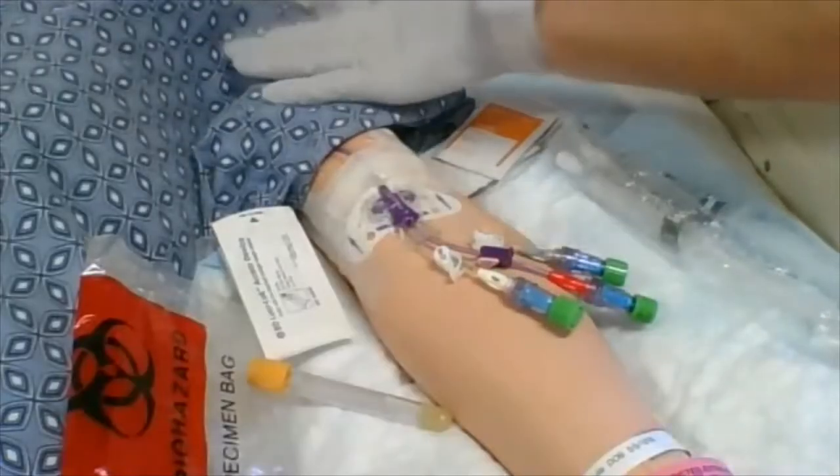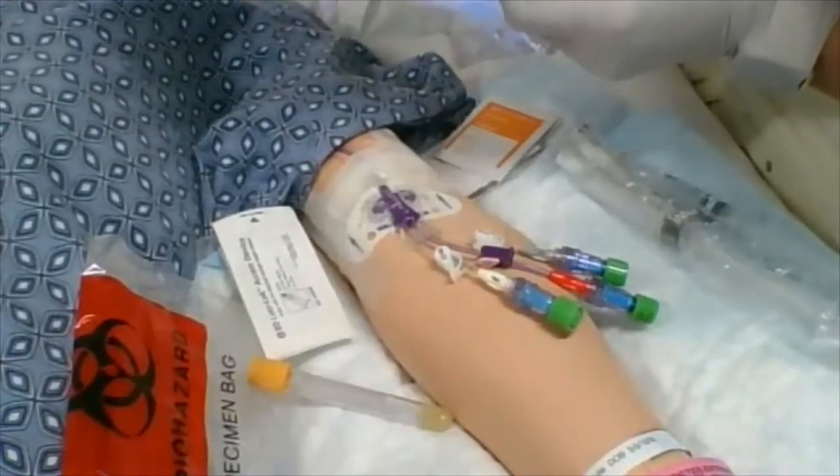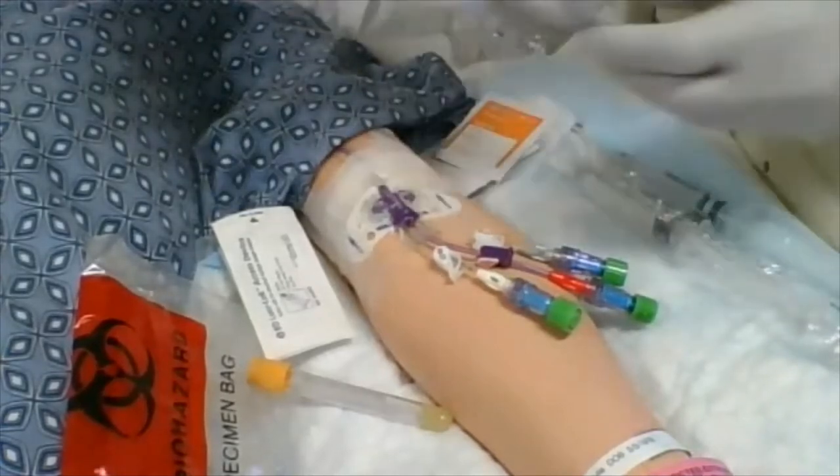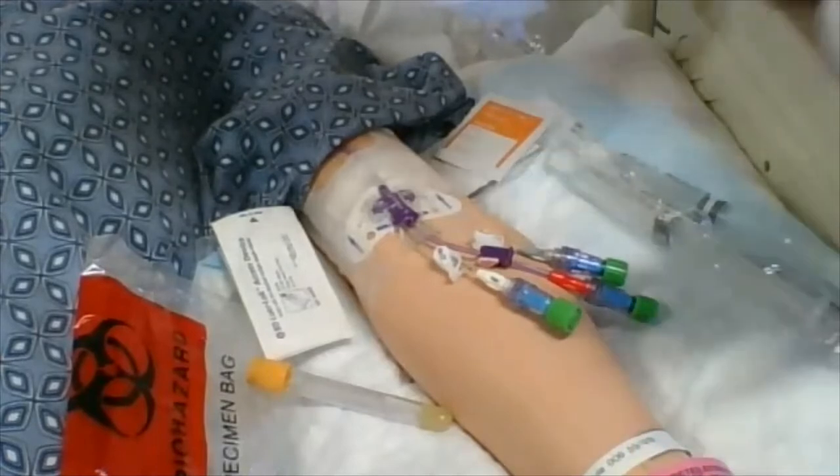I do want to just make sure — can you tell me your name and date of birth? I have my two patient identifiers and they match up. I'm going to put my labels right here so I don't lose them.